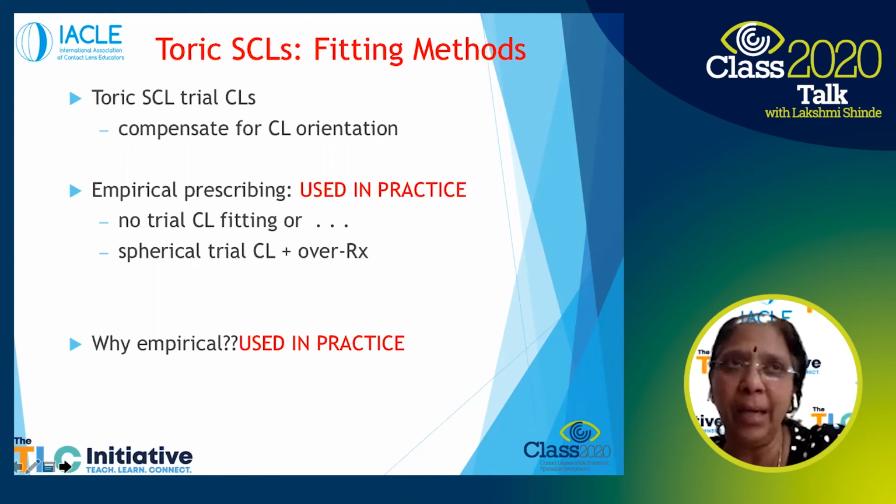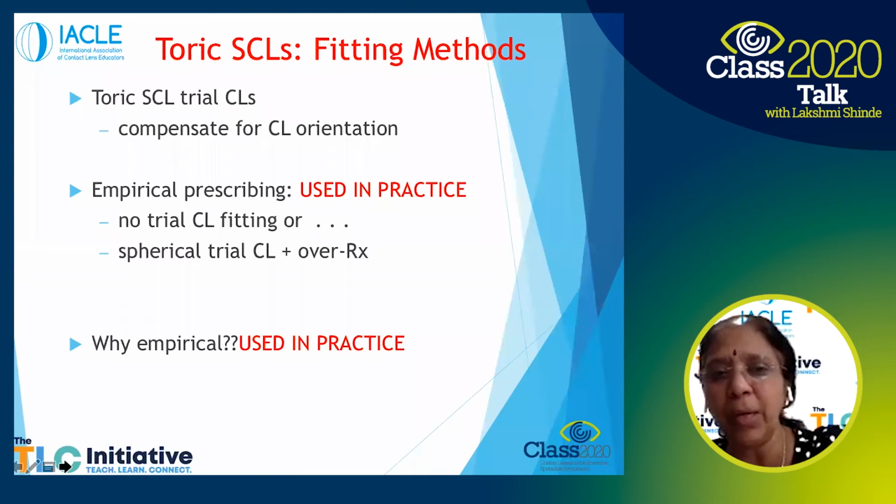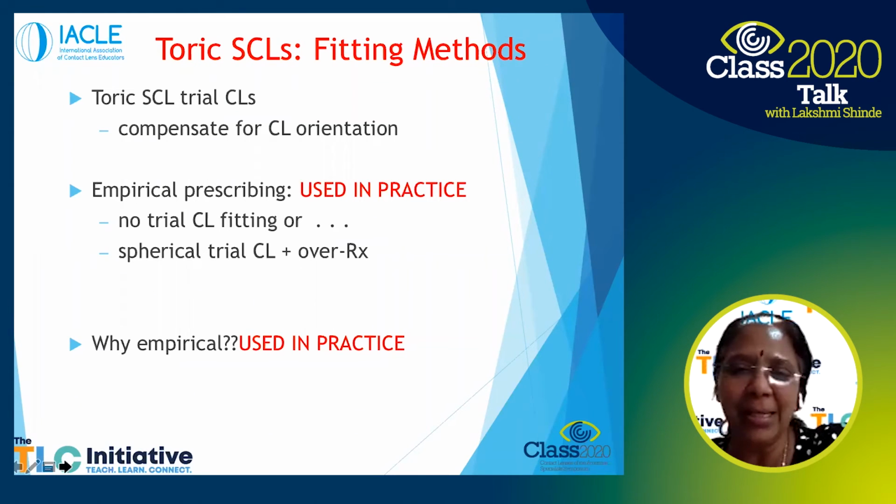I would label an ortho K or a scleral lens fitting as specialty. Even normal RGPs is not specialty anymore. So forget soft toric lenses. Even a normal RGP fit is not a specialty, which actually requires much more skill, I would say, compared to a soft toric lens. So definitely not a specialty fitting technique. I would say it's just normal.